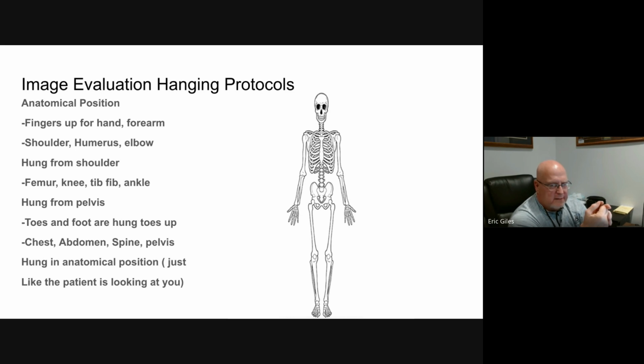And on your wrist or forearm, there's things you can look for so you know which one your radius and which one your ulna is on the screen. And that's going to tell you how that image is going to have to be annotated, and we'll talk more about that in a little bit. So just remember, fingers, hand, wrist, forearm, the fingers need to be up when the image is finished on your film. So if you take a picture and those fingers are pointing sideways or down, you know you've got to turn that picture upright. There's buttons that you just hit and it turns it for you. And then you need to make sure that that's a right hand or a left hand, right? Anyway, that's why it's a good idea to use your markers.